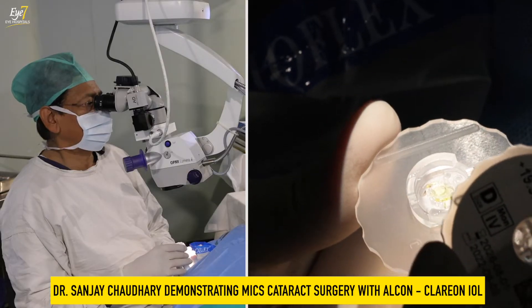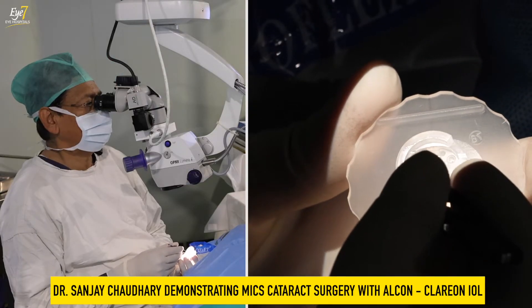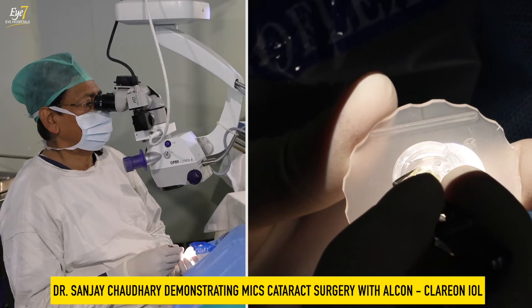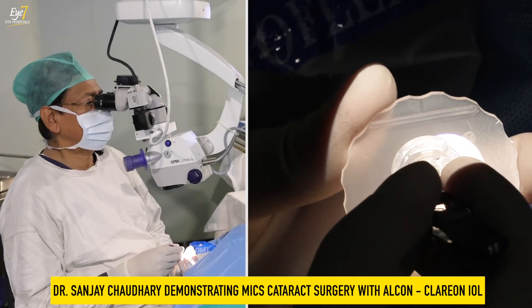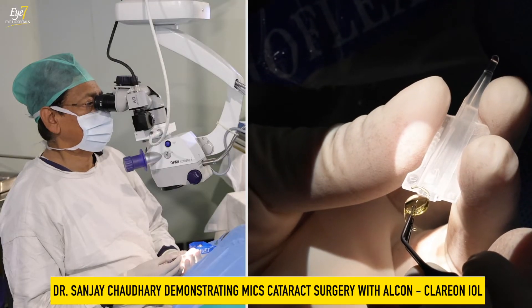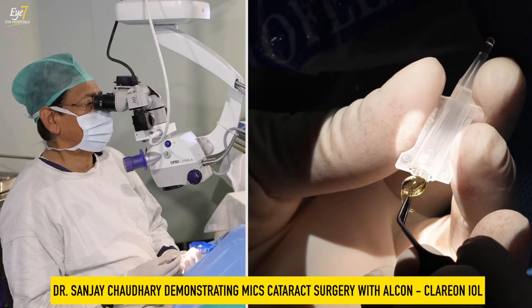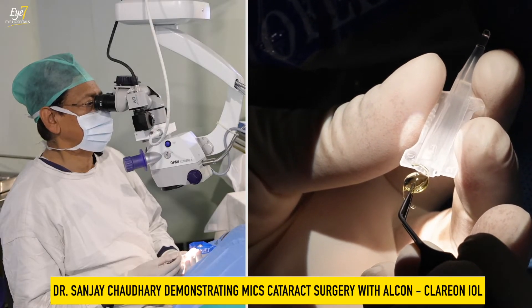It comes in this wagon wheel system. Previously they were pre-loaded, but now they've started coming in the wagon wheel system. This is the Clarion lens with the D cartridge, which is the cartridge used when inserting through a 2.2 millimeter incision.